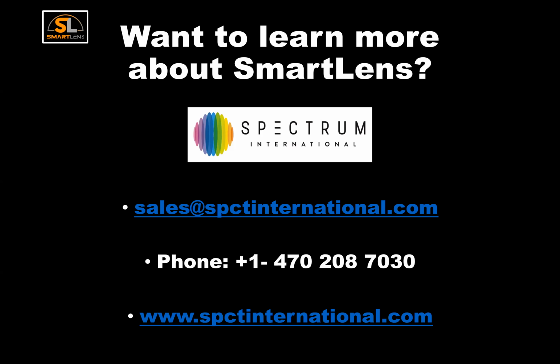And we have many transplant eyes that we really had to take out of scleral lenses because that eye was very close to expiring to begin with, and almost anything we put them into is just decreasing the oxygen. So I apologize, I'm not doing a very good job of answering this question, but I think if you're thinking that 200 microns will clear through most of the cornea and there isn't any point where you're going to be in touch, then you're relatively safe on most transplant eyes.